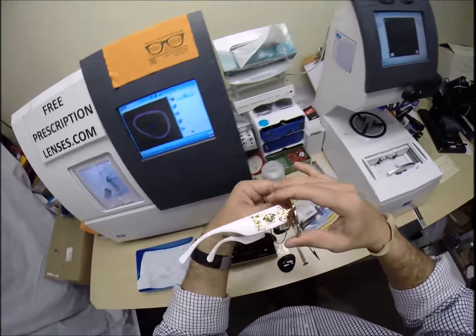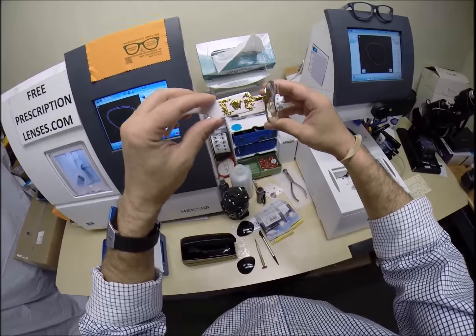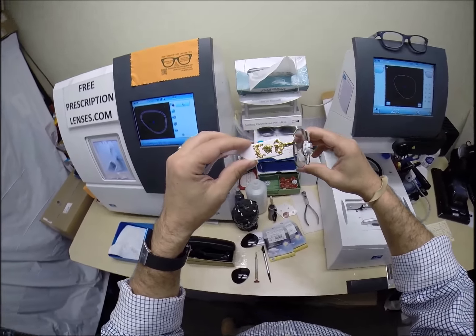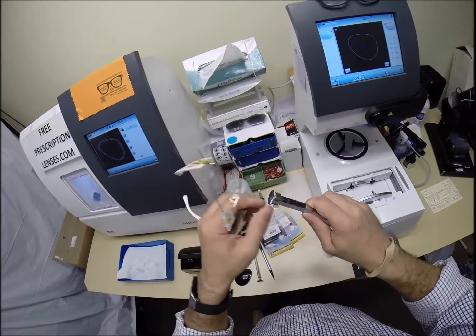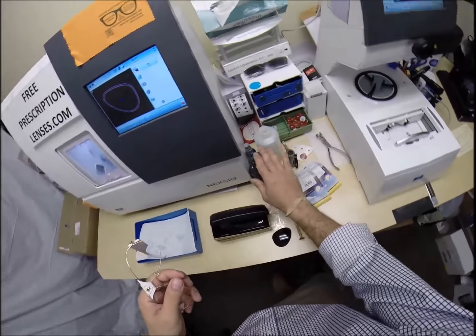Now I also get a lot of requests for white frames in the summertime because people go to whiteout parties. They wear a lot of white in the summer, especially in Houston. People dress in all white, from the Air Force Ones to the white Nike hat. And so this is a white frame you can still get. So I pop the block off, dry that off, add the sticker to my collection here.